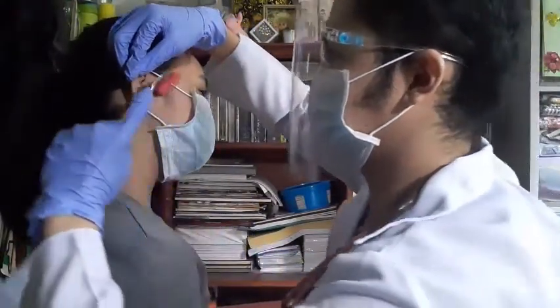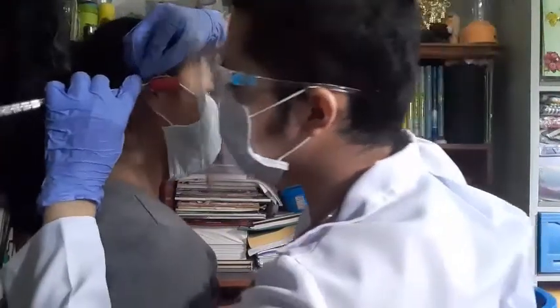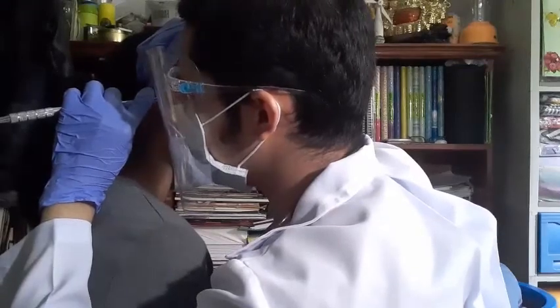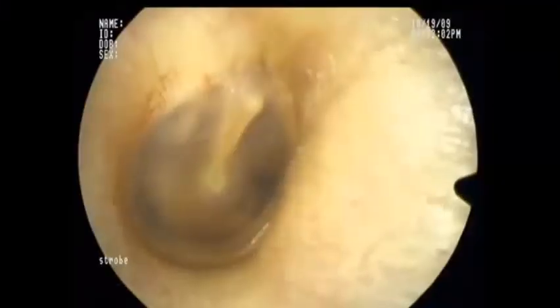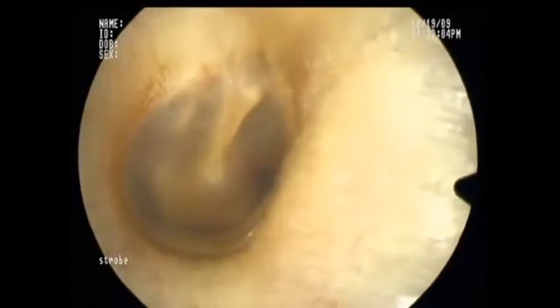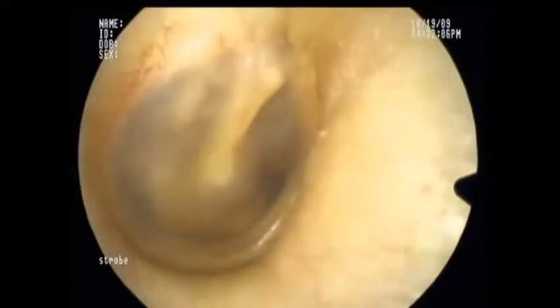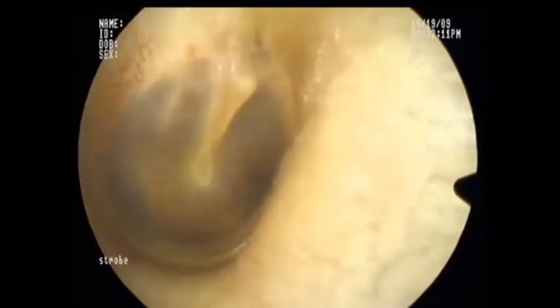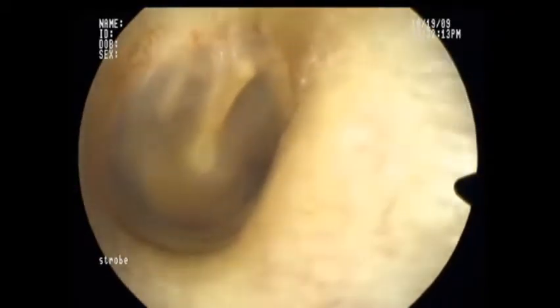Turn on the otoscope light and grasp the otoscope with the dominant hand in an upright position. Gently insert the otoscope in the external auditory canal and note for presence of wax, discharge, foreign bodies, redness, and advance until the tympanic membrane is seen and note its characteristics. Observe for any movement of the tympanic membrane as the patient performs the Valsalva. Repeat the steps on the other ear.